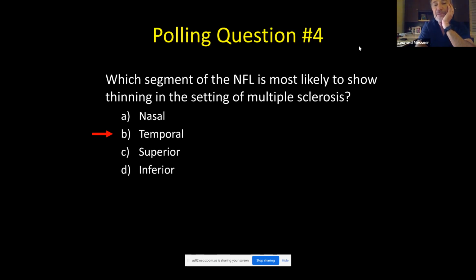Yeah, that's a great point, Greg. So Len, let me do this. You have Parkinson's, I believe, and Alzheimer's. We got a couple of questions rolling in here. At least one came in. It says, can you comment on the findings? So can you maybe give us the rapid fire of the pearl of Parkinson's, the pearl of Alzheimer's, and then we'll just wrap it up.